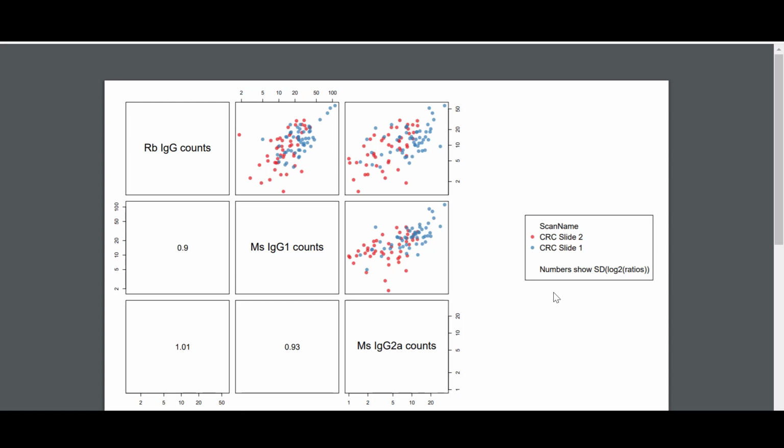Now looking at this graph, intuitively we expect an amount of dynamic range for these negative antibodies. This is a function of those technical factors we mentioned earlier, such as smaller and larger AOI areas and tissue differences. In this particular plot, we're looking to answer two questions. One, are these negative antibody counts stable and high enough to be used for normalization? And two, are 2 to 3 of them correlated enough such that we consider background robust for normalization?